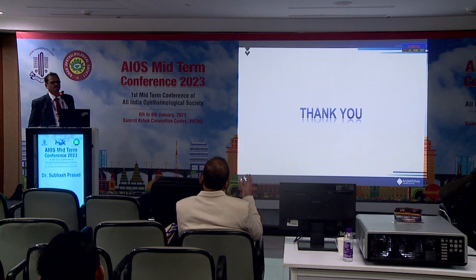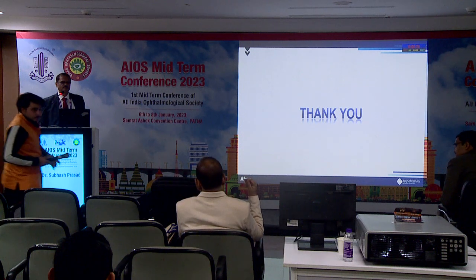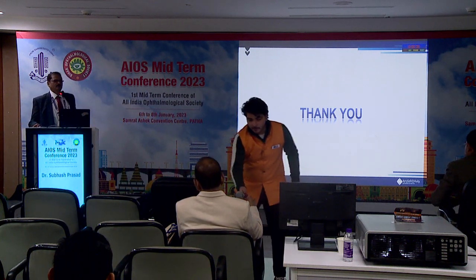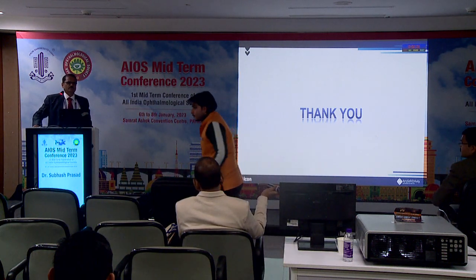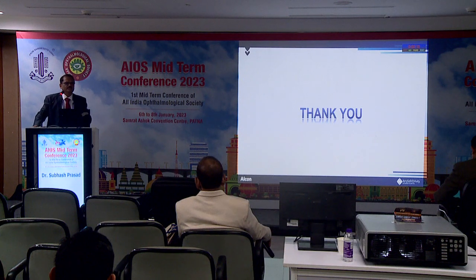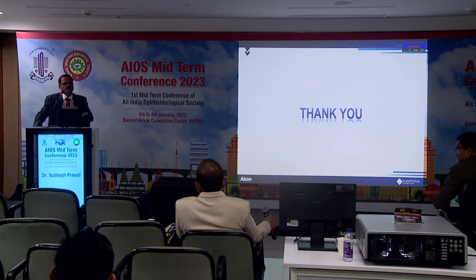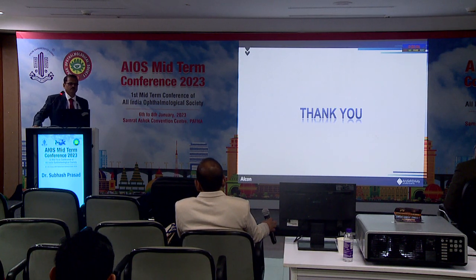What is your experience if you have a 0.75 cylinder? Sir, up to 0.75 they easily accept. I make the incision on the steeper meridian, and once it is 1, I always use the toric, because even a slight amount of astigmatism can cause much more disturbance in trifocal lenses as opposed to monofocal.